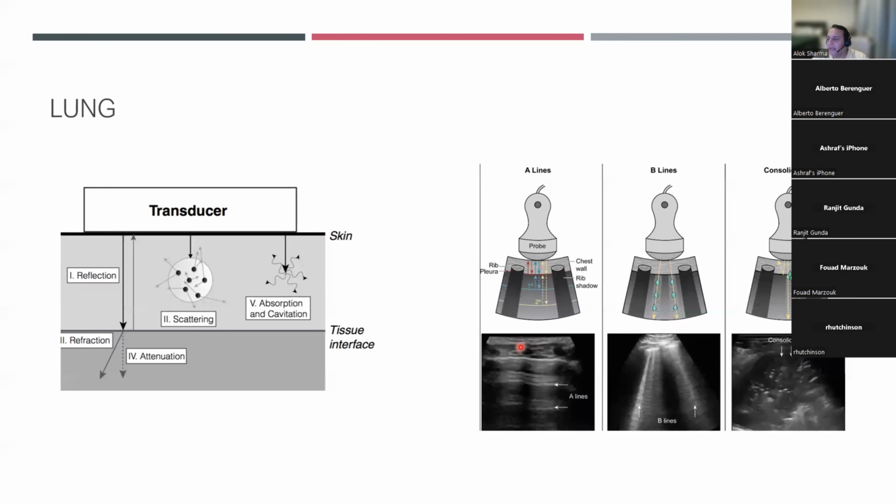Now we know that bone has a higher density, so a much higher reflectivity, which means that there are going to be fewer sound waves going in here. So naturally, behind the bone, because you have fewer sound waves, you're going to have this phenomenon of an acoustic shadow. But more importantly, you are also going to see reflection which is poor at the margins, because the waves are incident not at right angles, but in a much wider way.